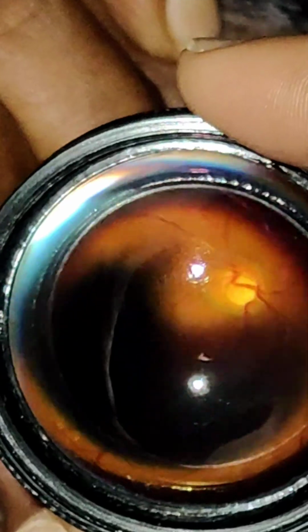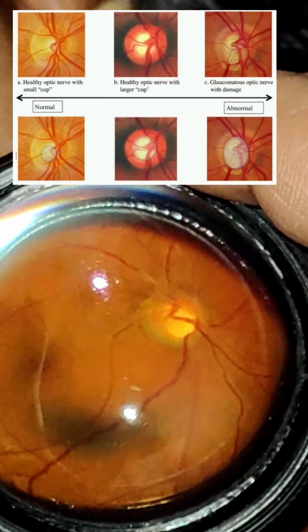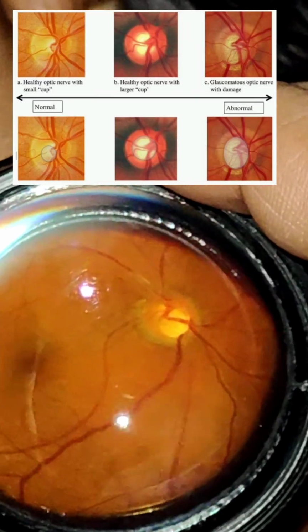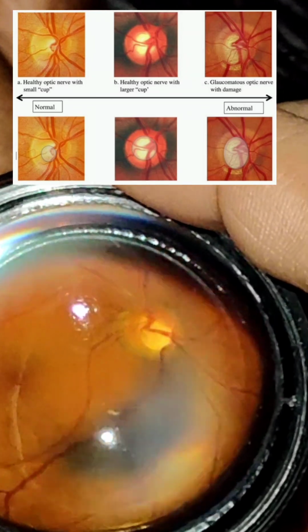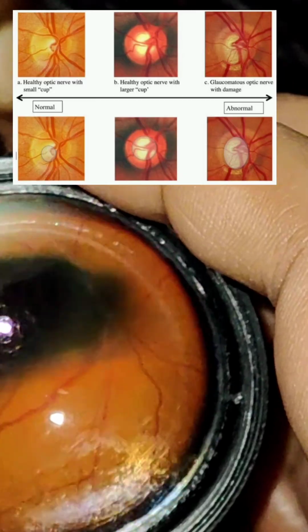area. The disc is showing a vertical disc height of 1.4 with a cup disc ratio of 0.9, and the inferior rim is completely eroded, violating the ISNT rule, and it is an advanced glaucomatous disc. He underwent trabeculectomy in both eyes, and the wound is healthy, bleb is seen.